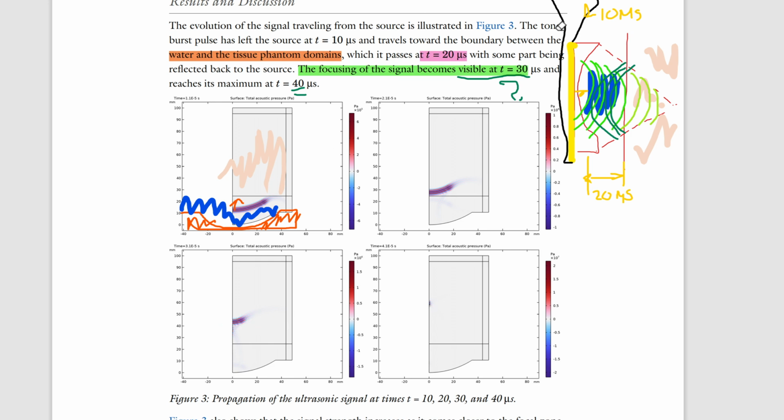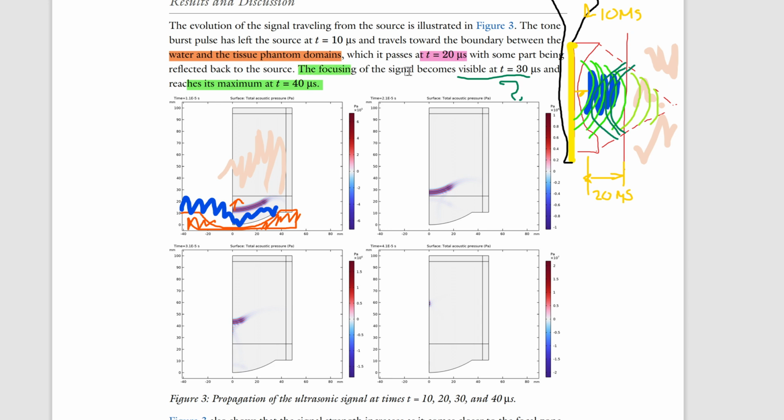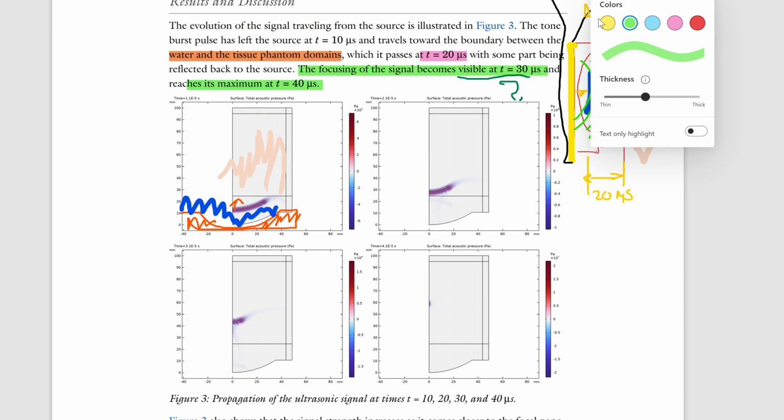Okay, makes sense. And then it says it reaches a maximum at time equals 40 seconds, 40 microseconds. So now we know that. I would put that green. We understand what's happening here. We have focusing happening here. Maximum focusing. Smallest point. Let's give ourselves a pat on the back for that.